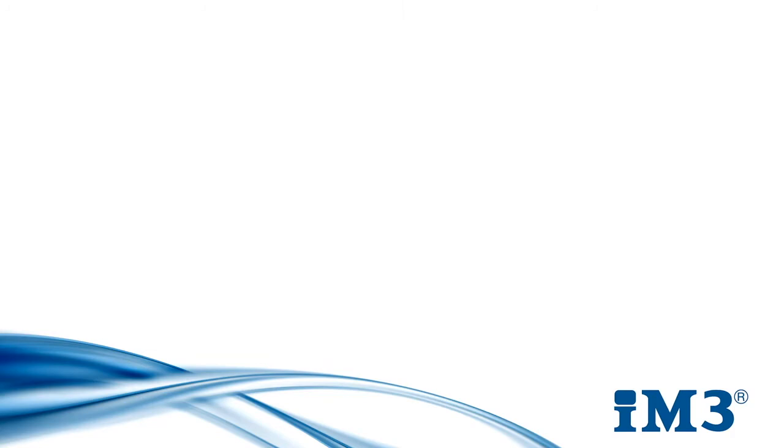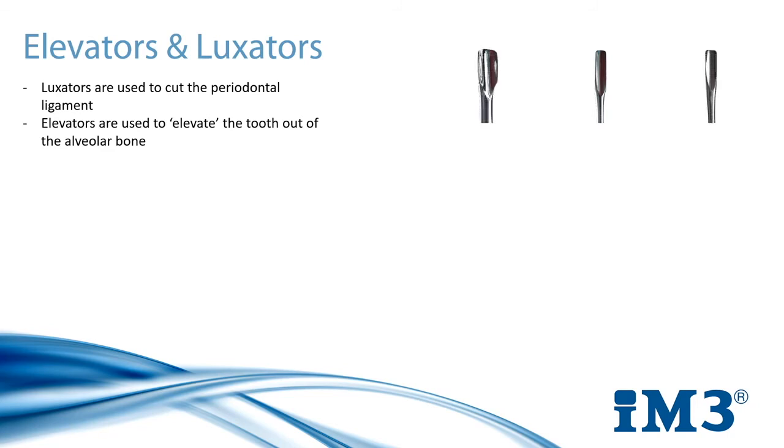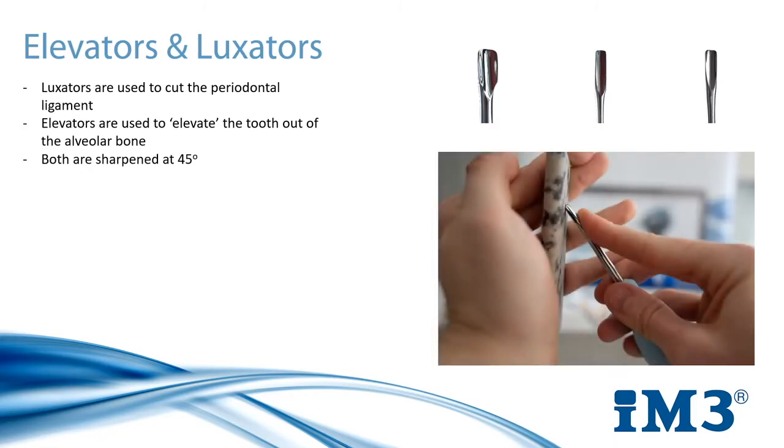Next on our list of hand instruments are elevators and luxators, both of which play their own very important part in tooth extraction. Luxators are used to cut the periodontal ligament and therefore are always used before an elevator. Elevators are used after the periodontal ligament has been successfully cut to elevate the tooth out of the alveolar bone. They come in two forms — winged elevators or straight elevators — and both do the same job, however it depends on user preference. All three of these instruments are to be sharpened at a 45-degree angle using the same sharpening stone used for the scaler and curettes.